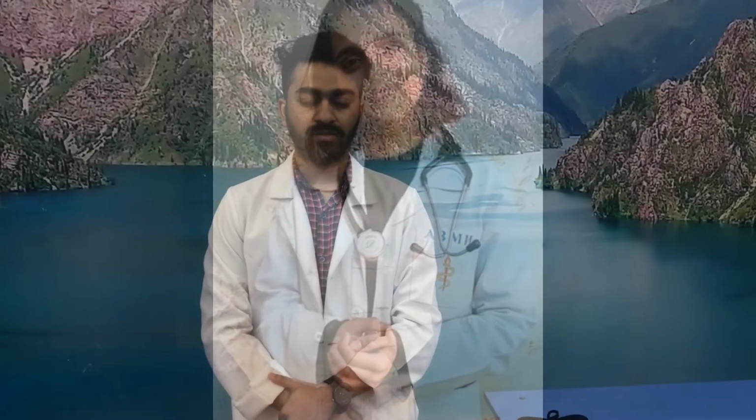Thank you. So now we are going to talk about CECT abdomen, that is contrast enhanced computed tomography. So if a patient comes after some trauma, we have two options with us. One is that if the patient is stable, we can go for CECT. If the patient is unstable, then we can do EFAST.